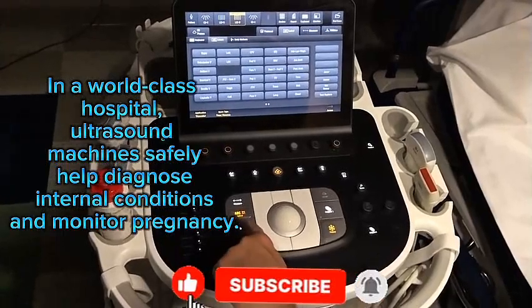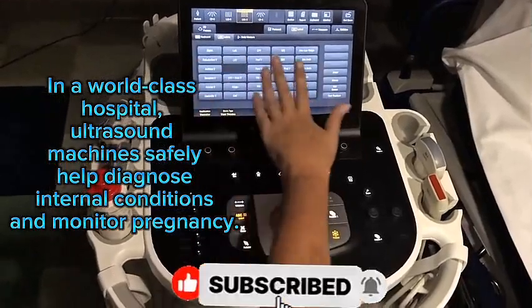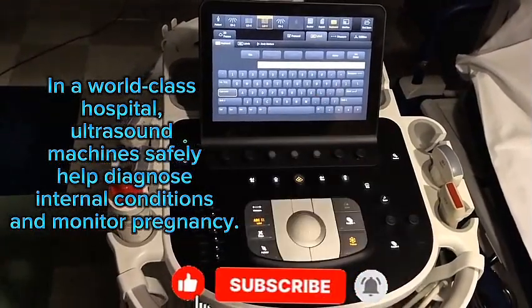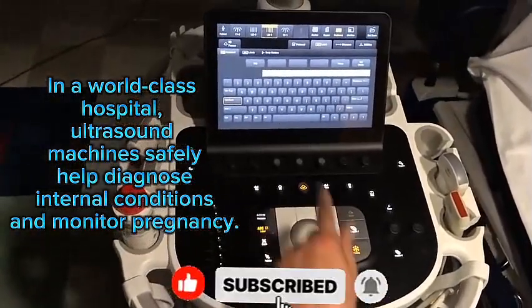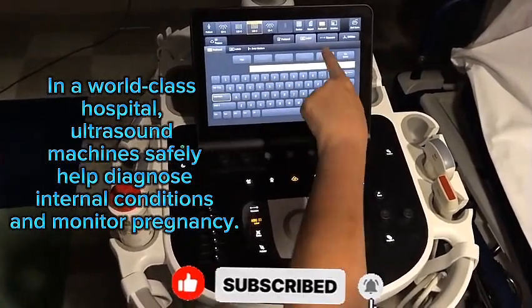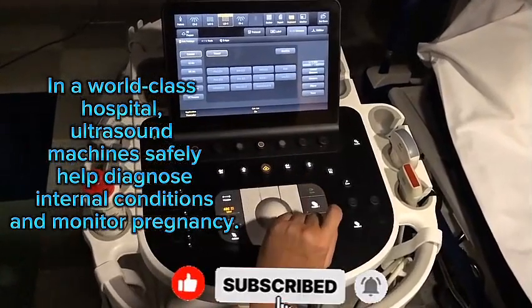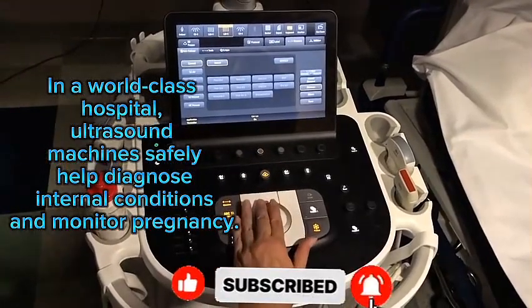And again, annotation is by hitting the ABC label here. You can use the automatic on the touch screen, or you can go to keyboard, use this keyboard, or this keyboard if you prefer. You'll notice these tabs up here. You can go from the annotation screen to a measurement, and you can assign this to different packages if you want, or just go back to labeling and then measure separately on your own.